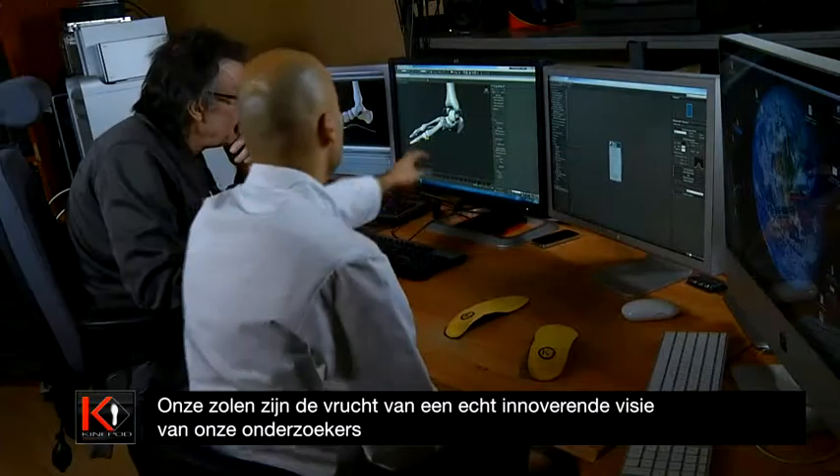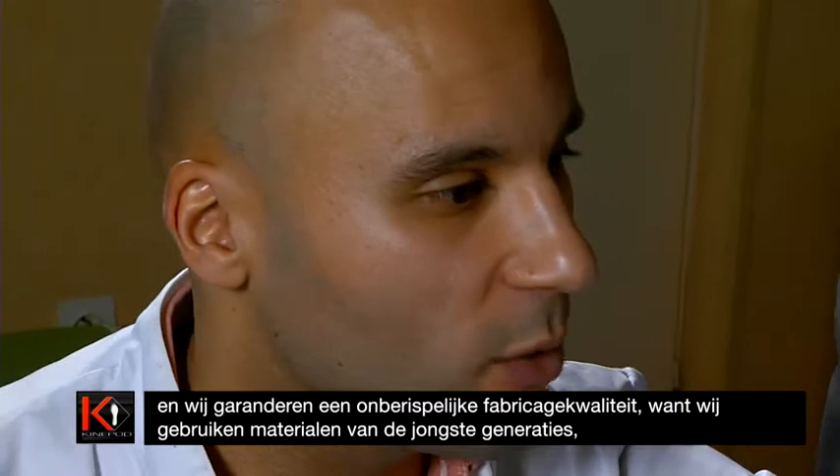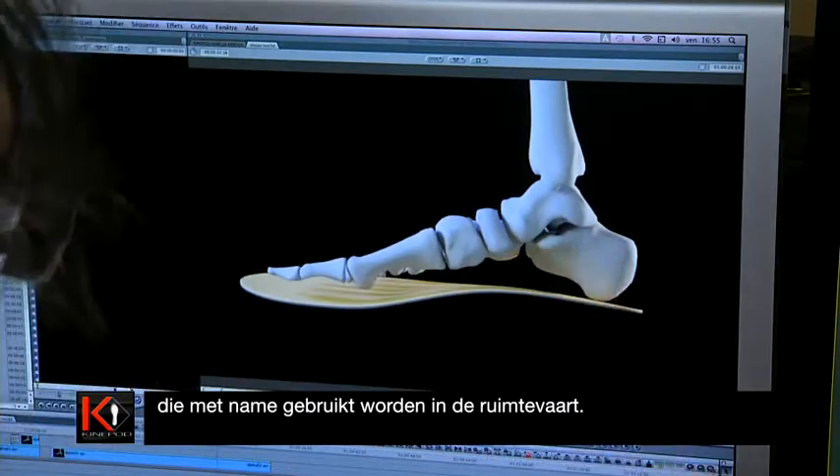Our soles are the result of the exceptional innovative vision of our researchers, and we guarantee irreproachable manufacturing quality, because we use the latest materials — also used, for example, in the aerospace industry.